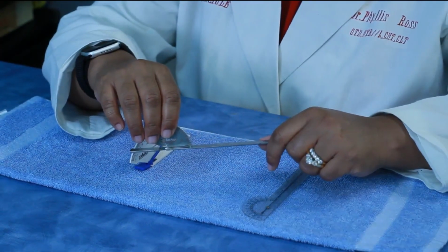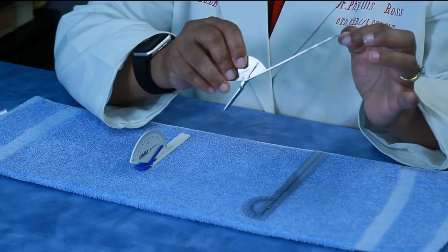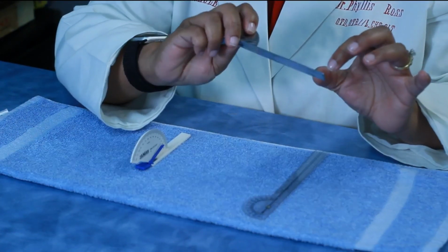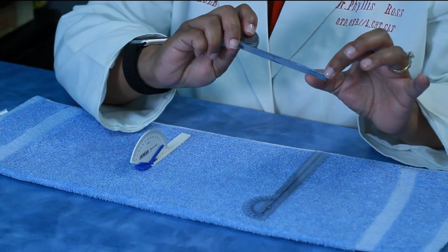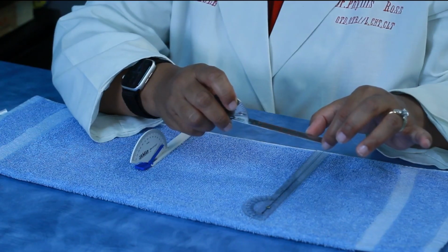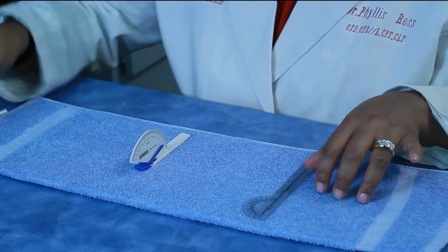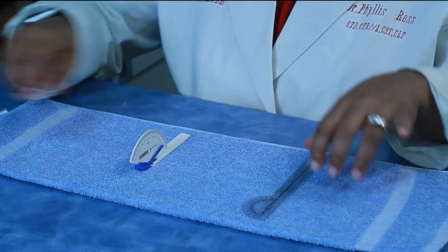What's nice about this one is if you were measuring someone who had limitations maybe with opposition and you wanted to measure from pulp to pulp, this one does have a ruler attached to it. But that's for another time. I will put this one aside, but just wanted to bring it to your attention.